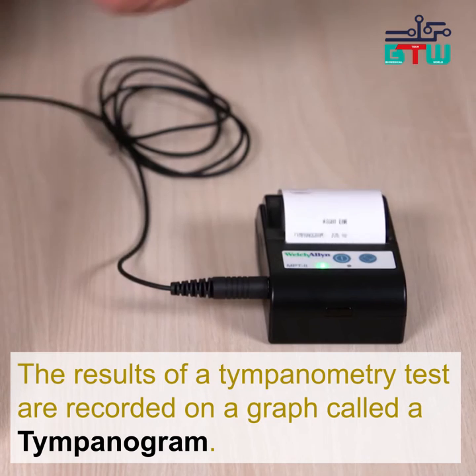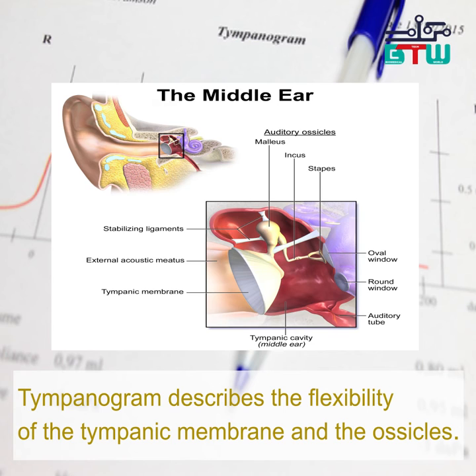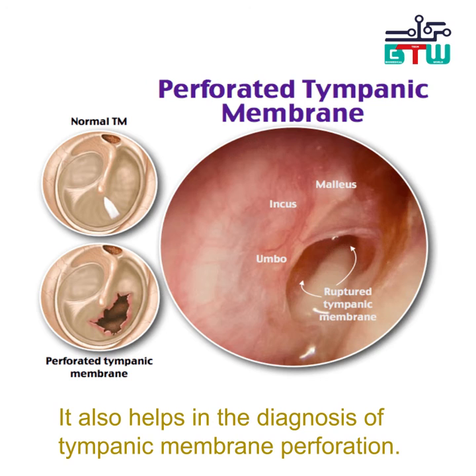The results of a tympanometry test are recorded on a graph called the tympanogram. Tympanogram describes the flexibility of the tympanic membrane and the ossicles. A tympanogram represents the relationship between the air pressure in the ear canal, and the compliance of the middle ear. It also helps in the diagnosis of tympanic membrane perforation.